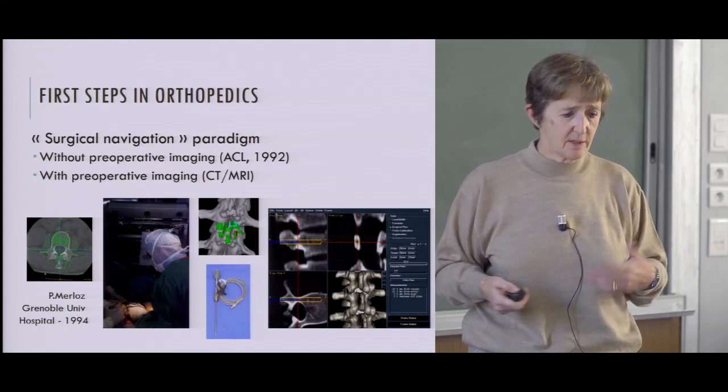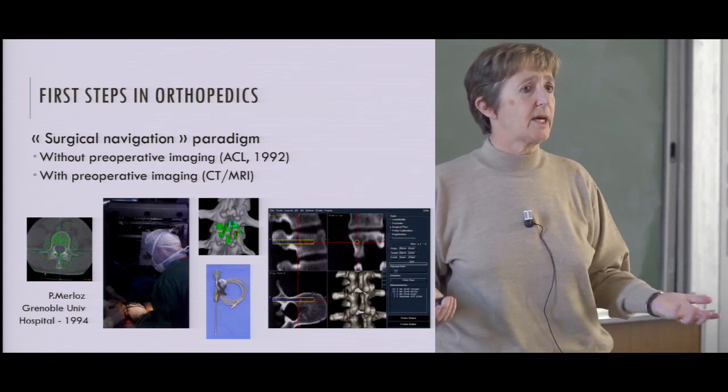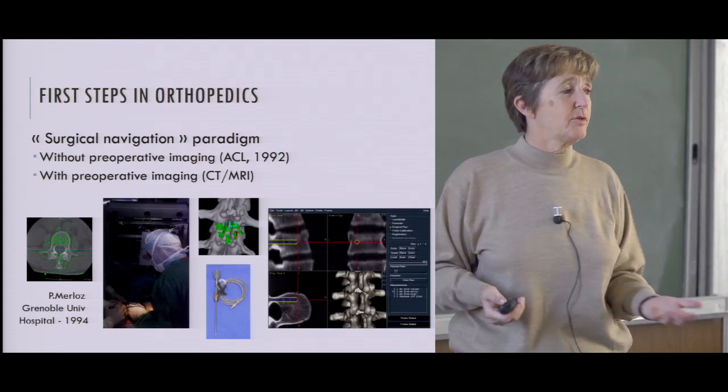So here is navigation. It's like you're in your car. It tells you where you are and where you should go, but afterwards you can do what you want. It's what we call passive assistance.